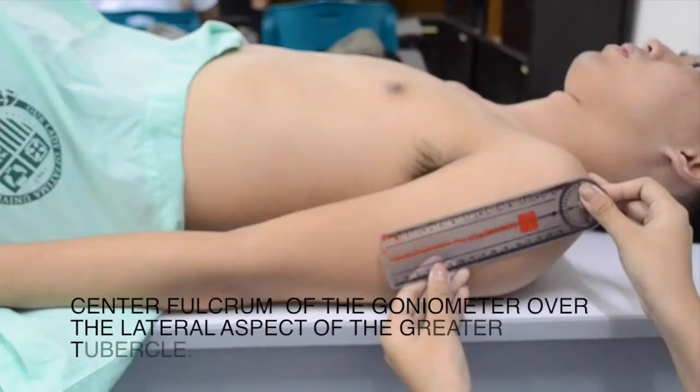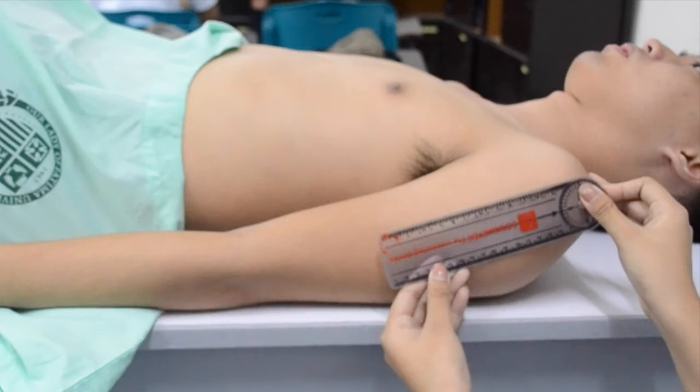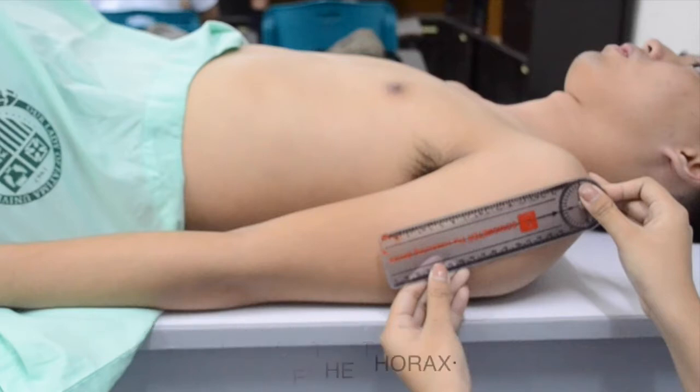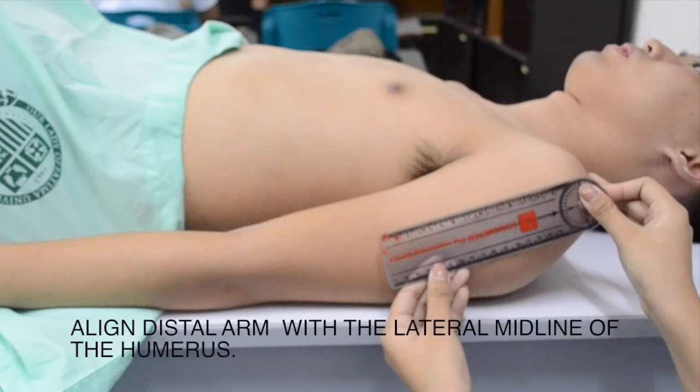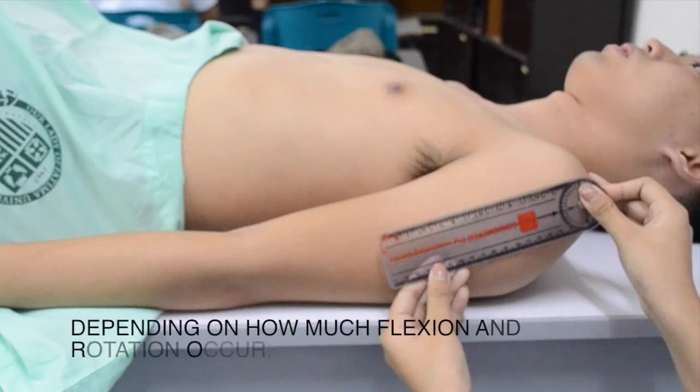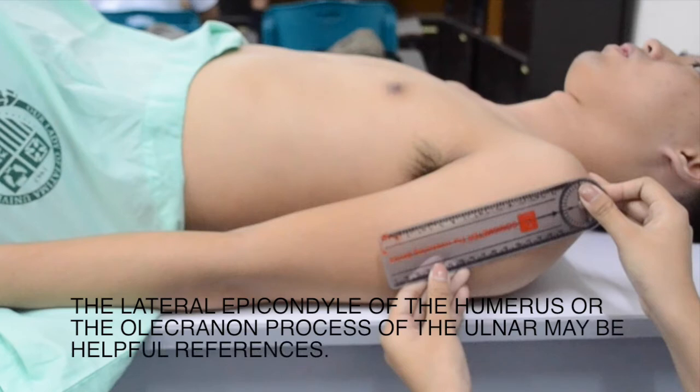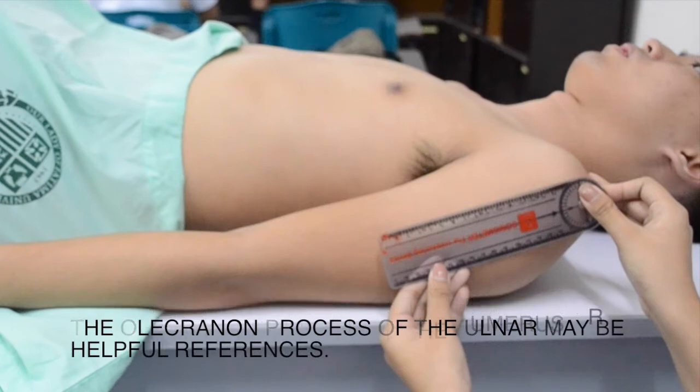Center the fulcrum of the goniometer over the lateral aspect of the greater tubercle. Align the proximal arm parallel to the mid-axillary line of the thorax. Align the distal arm with the lateral midline of the humerus. Depending on how much flexion and rotation occur, the lateral epicondyle of the humerus or the olecranon process of the ulna may be a helpful reference.